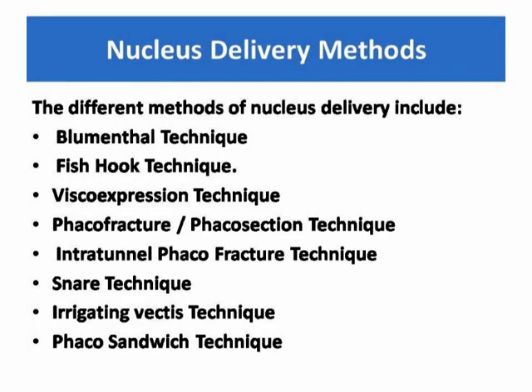The different methods of nucleus delivery include Blumenthal technique, fish hook technique, Visco expression technique, Phaco fracture, Phaco section technique, intratunnel Phaco fracture technique, snare technique, irrigating vectis technique and Phaco sandwich technique.